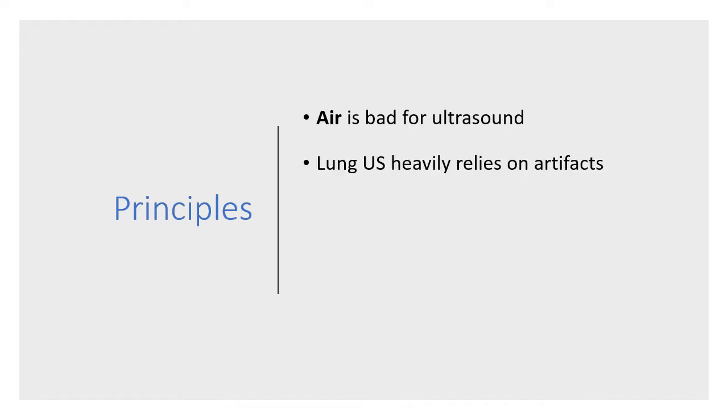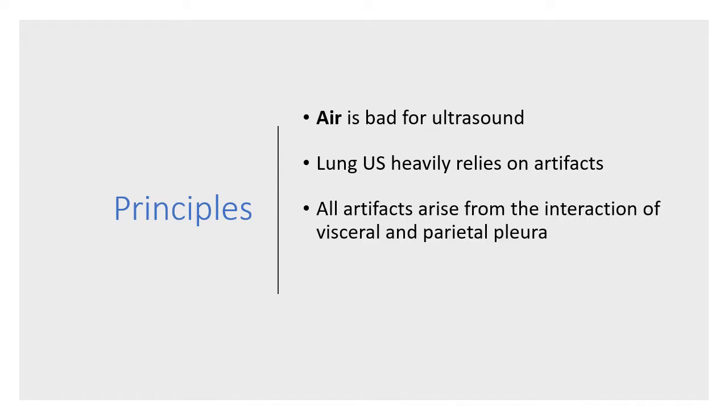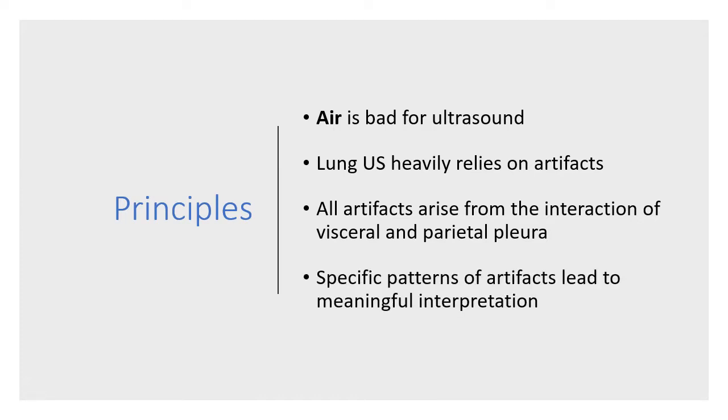Therefore, lung ultrasound actually relies on artifacts, and these artifacts arise typically from the interaction of the visceral and parietal pleura, and specific patterns of artifacts can lead to meaningful interpretation and help us differentiate different types of pathology.